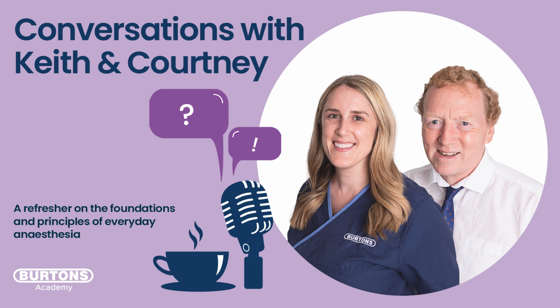And I think that there's some confusion about what less than 1 to 2 means. Is 1 to 3 a lesser ratio than 1 to 2, or is 1 to 1 a lesser ratio than 1 to 2? My math type brain says that 1 to 3 is a greater ratio than 1 to 2. So I'm going to say that things are greater than 1 to 2. In other words, 1 to 3, 1 to 4, 1 to 10 are absolutely fine. Just don't go below 1 to 2. In other words, don't go to 1 to 1.8 or 1 to 1.5 or even 1 to 1.